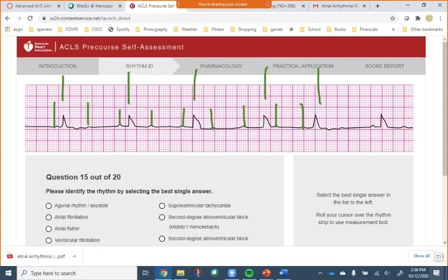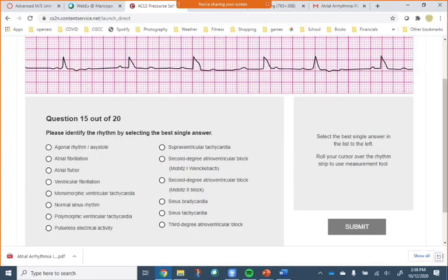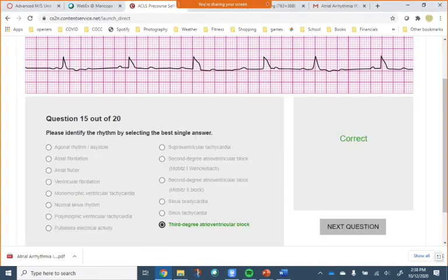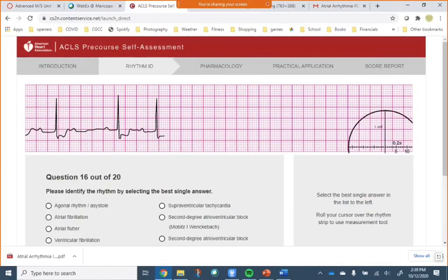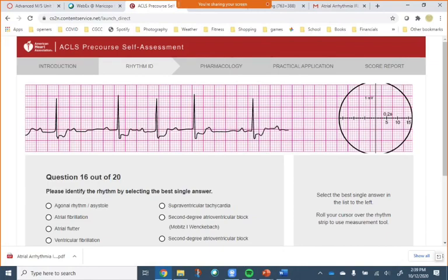And if you guys can tell this, you're already amazing cardiac nurses. And you're right, this is a 3rd degree AV block. And you are correct. Look at you guys, you're amazing. You're already passing ACLS. You don't even need to name it to know which algorithm to go to. We gave you Brady's, atrials, ventriculars.